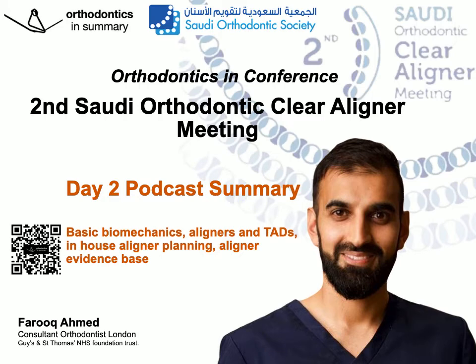He gave the advantages of using aligners and mentioned how they are effective for anterior alignment and also comparable to fixed appliances in the buccolingual changes. But these come with disadvantages, and they are not predictable when it comes to excessive movements in the horizontal plane, and most cases require additional refinement. He then spoke about the biological limitations and described actually the limitations that we have are the same as they are for fixed appliances, with RANKL and osteoprotegerin being in the same quantity as they are for fixed appliances.